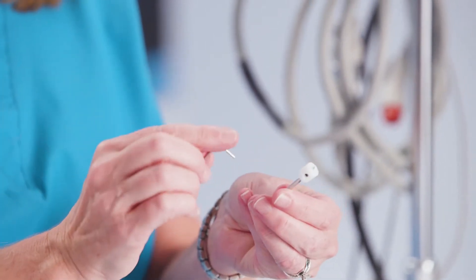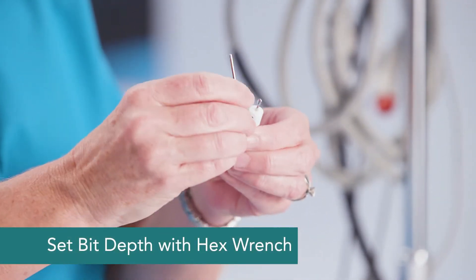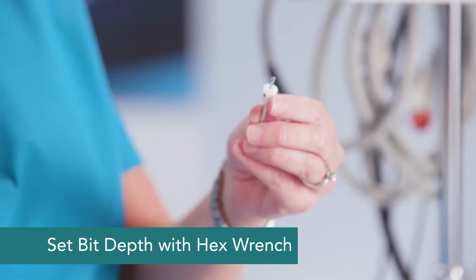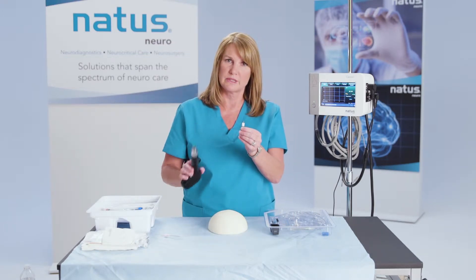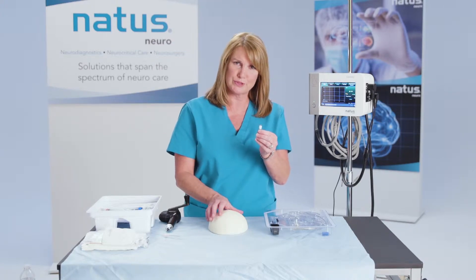We're going to use the hex wrench, and this is simply to set the depth of your skull. Of course, this would go into your hand drill. For demonstration purposes, I've already created the hole through the skull cap here.